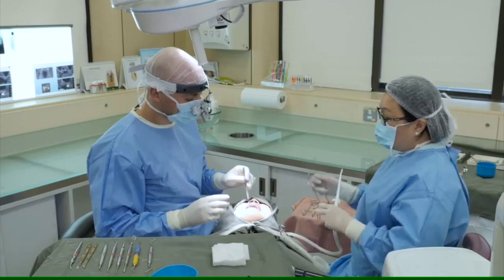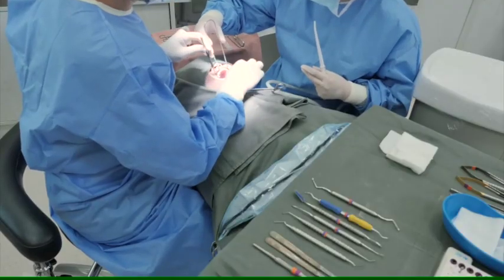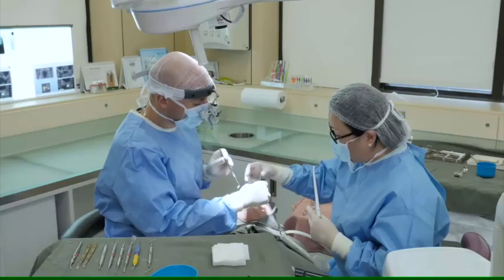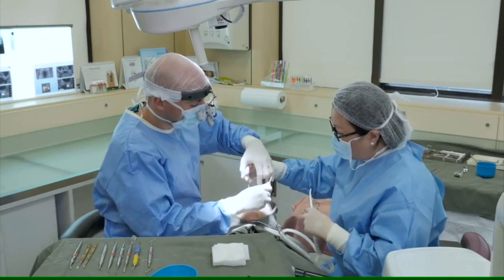The same applies to your assistant — he or she will also need a tray on their right side with some essential instruments to make your life easier during surgery. Try to minimize any movement and any type of searching.